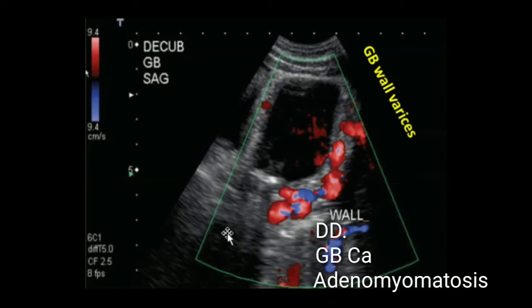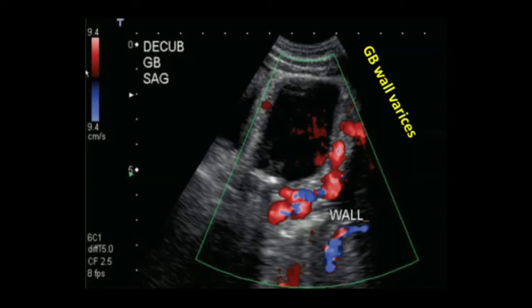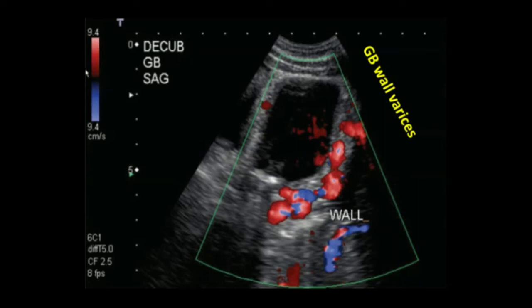The pulse Doppler is much more informative in making this differentiation.